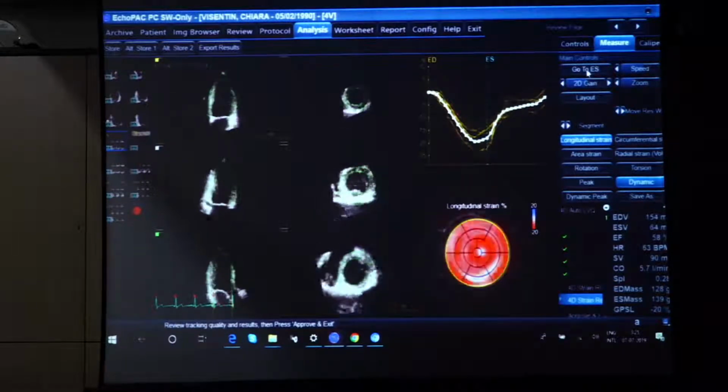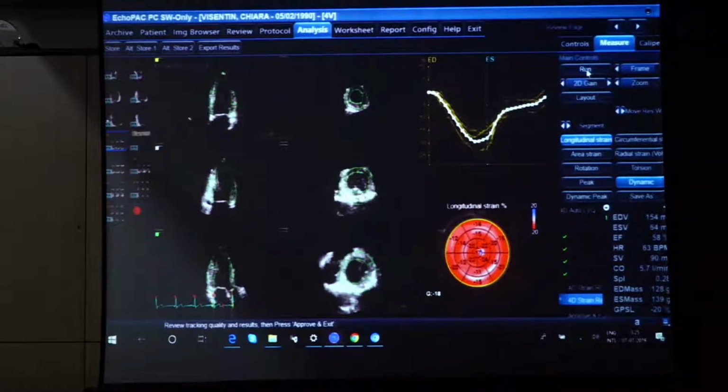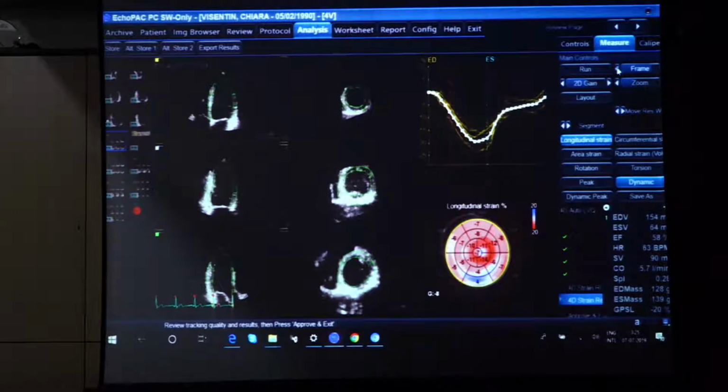that I can see only if I stop running the cardiac cycle, because changing frame by frame, I can change the strain. So I have frame by frame strain throughout the systole and the diastole. And this is different from the one before, because now it is the average of the peak value at this point in time during the cardiac cycle.